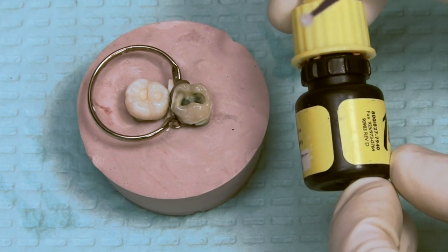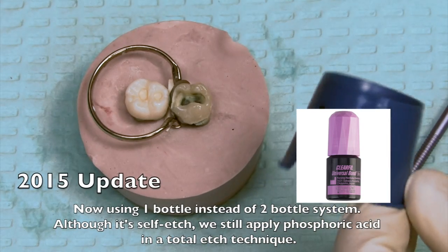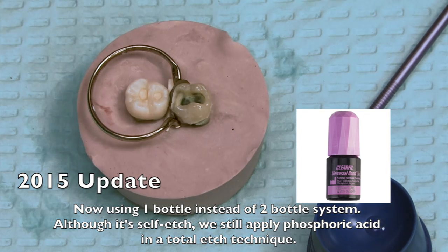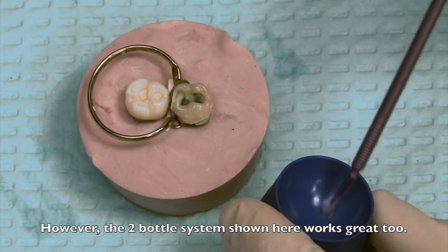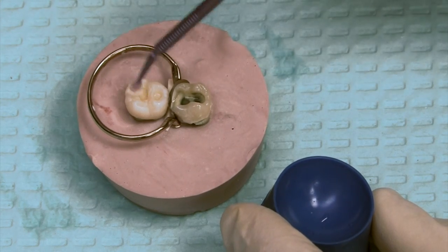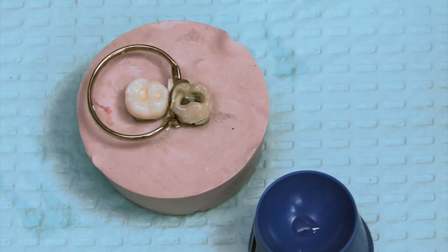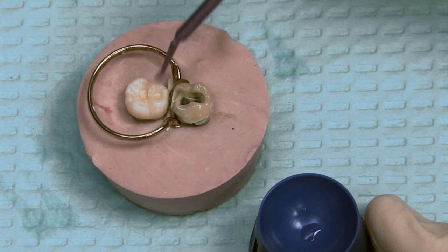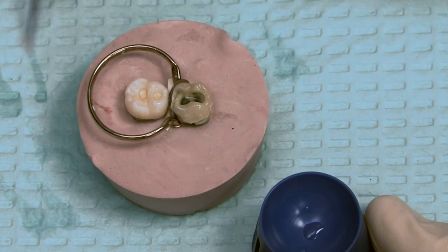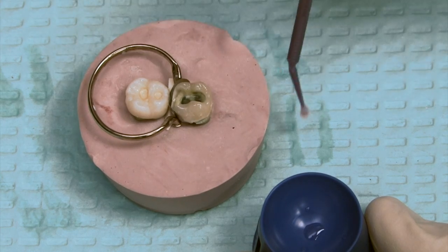The second step is the primer — the self-etching primer. We use the purple brush for primer. Get a brand new dappen dish and put in one drop. Just scrub it along the dentinal floor, scrub it along the side walls, get it up and over the occlusal surface margin. This material must be worked in and be contacting the surface for a minimum of ten seconds. By the time you apply it, scrub it, blot dry, and then go in with your air to thin it, that will be ten-plus seconds for the whole process.